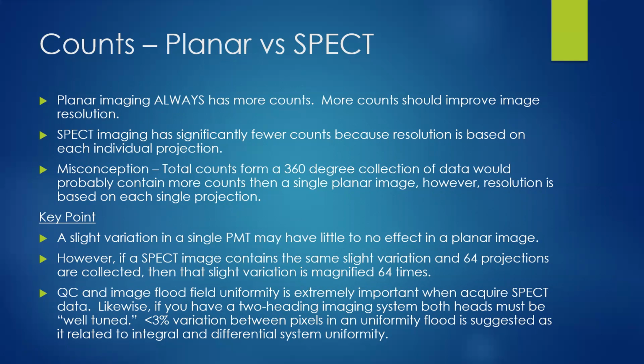But here's the problem with that analysis. A SPECT scan is only as good resolution-wise as any one individual slice. So if you're going 20 seconds on a cardiac or 25 seconds on a brain scan, then whatever counts are in that individual slice is as good as what your resolution theoretically is going to be. So that to me is a misconception.